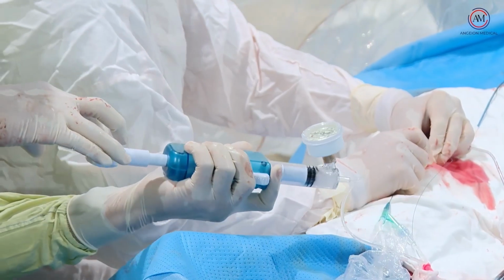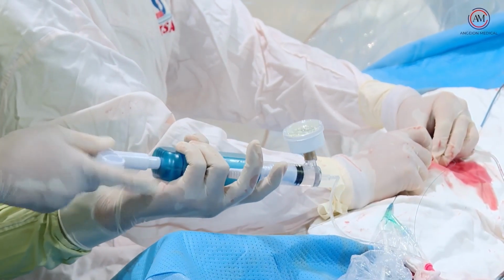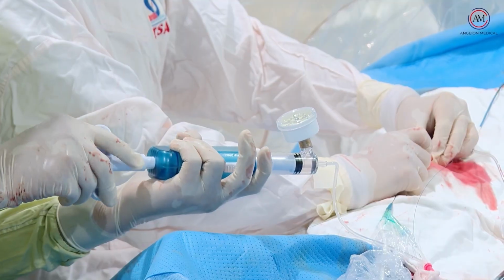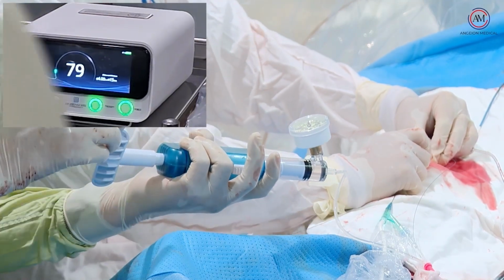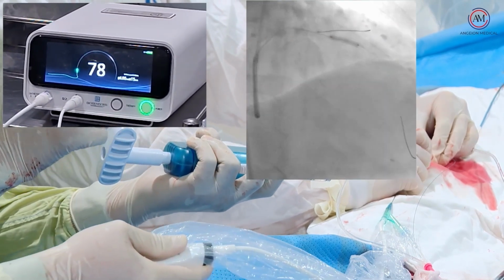I'm ready. 2, 4, and 6. Okay. We will stop.